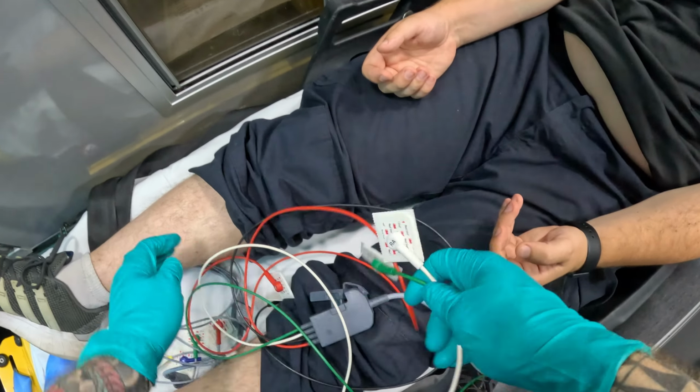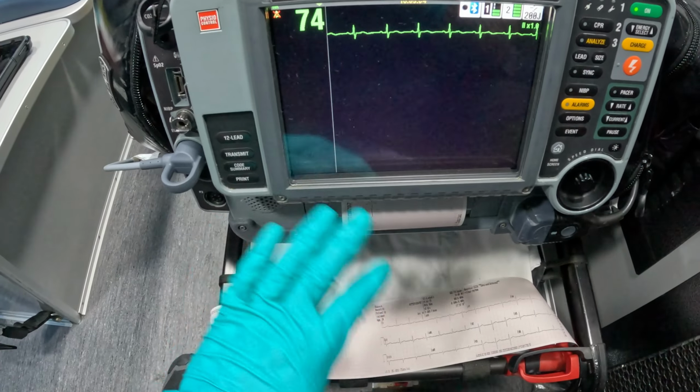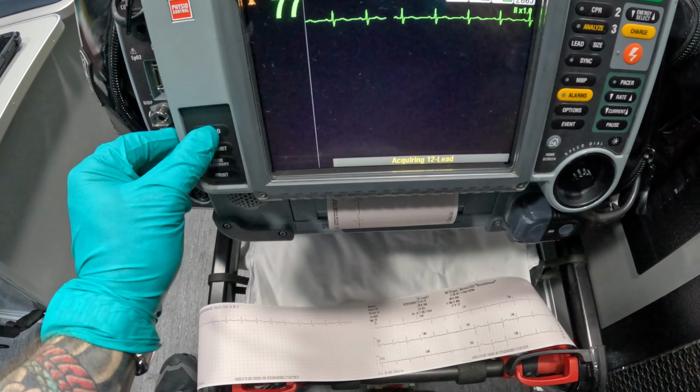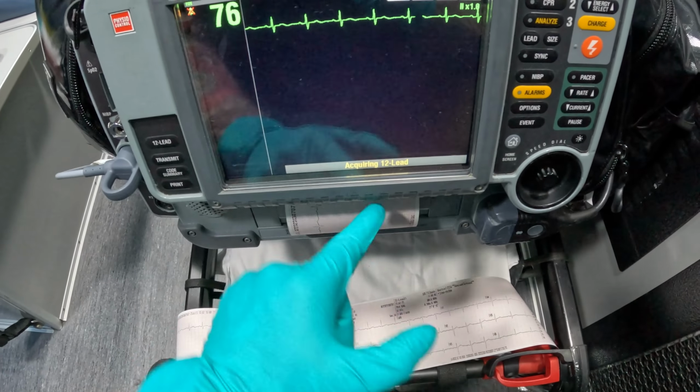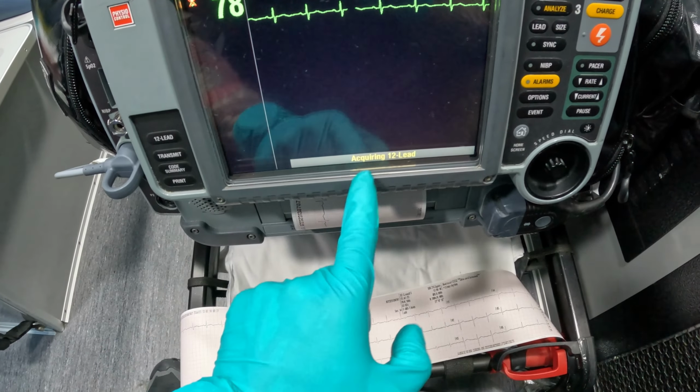Your CC medic. Just to make sure you remember how to perform this: for your regular strip, you just click print. I'm just going to click a little piece. You click print again, stopped. Then you click 12 lead. Because we already entered the demographics, everything is already in there one time. So now when it acquires the 12 lead, it's going to print another one for you.